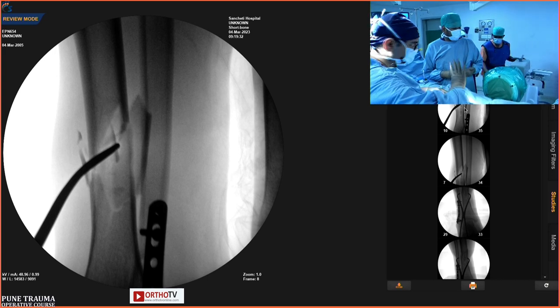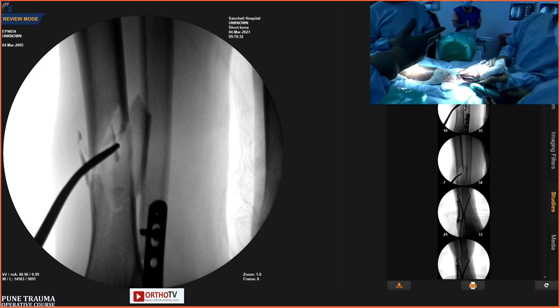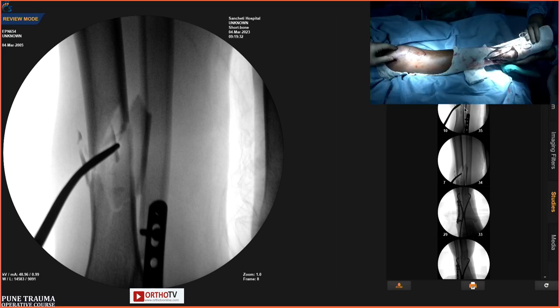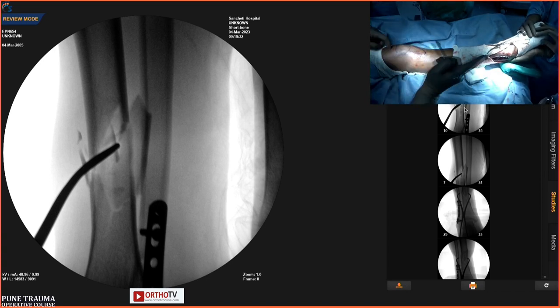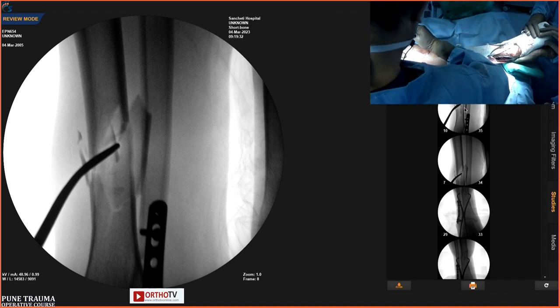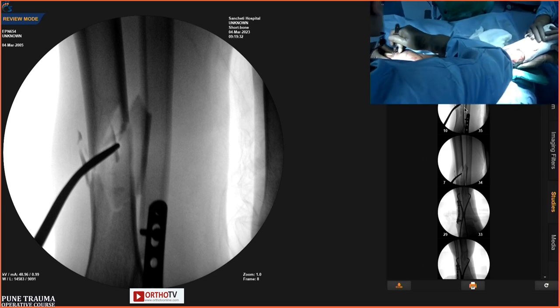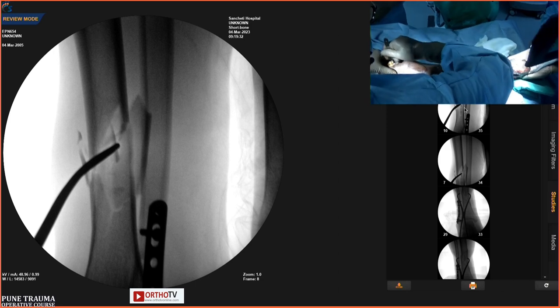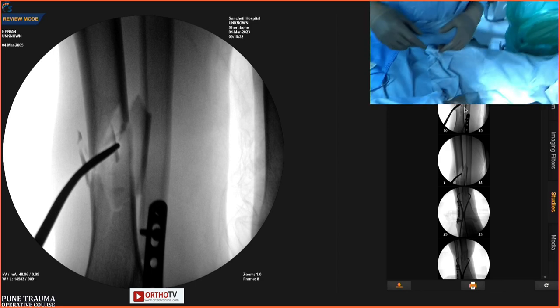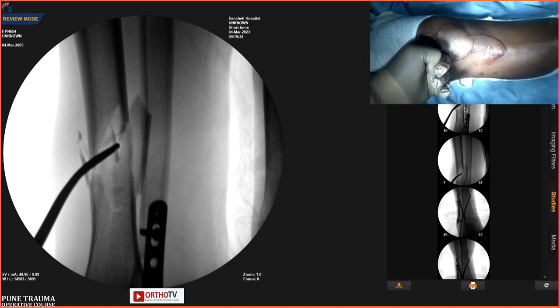Then what he will do after giving an incision, he will put the artery forceps underneath the patella to break all adhesions. Sir, do you expect adhesions? Whatever it may be, there may not be any, but it is always better to take the precaution. So he has given the incision about 2 centimeters, and underneath the finger must go inside the patella, and now he is breaking the adhesion.